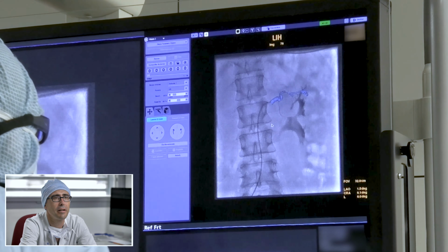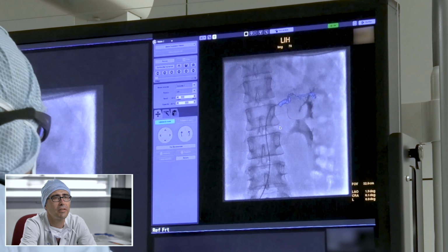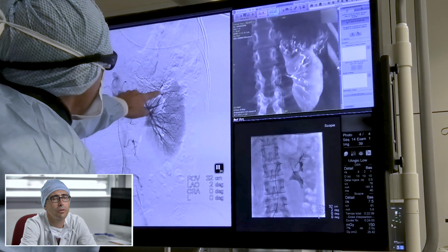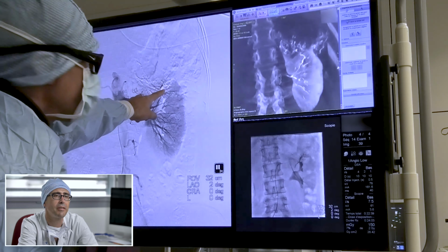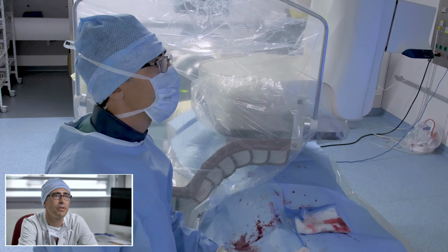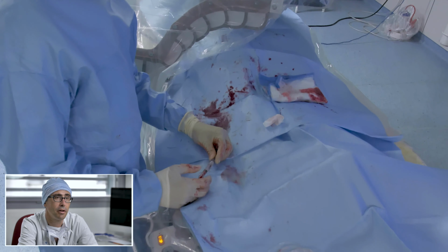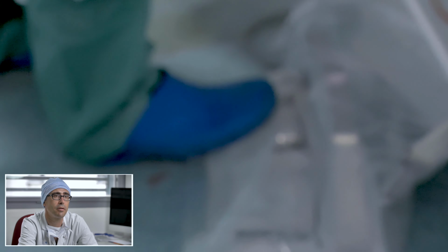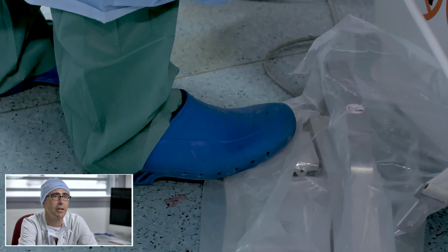Cone beam CT and software like Embo ASSIST are helping us to improve our standardization of the procedures. In our practice, Embo ASSIST helps us to decrease the number of DSA and thus the dose to organs and the dose of contrast media. The GE solution helps us in our practice by reducing the variability encountered every day.